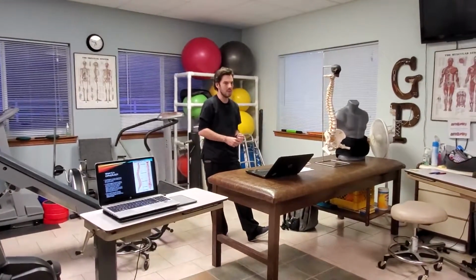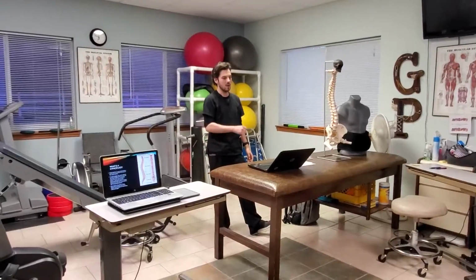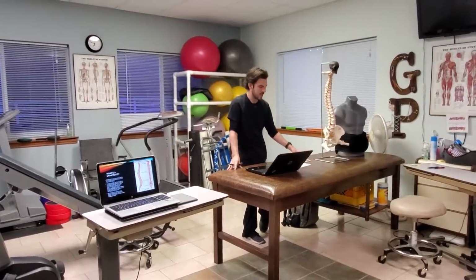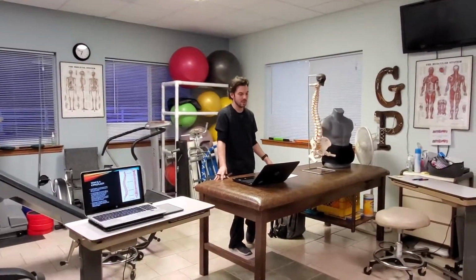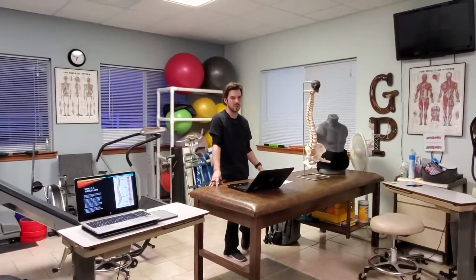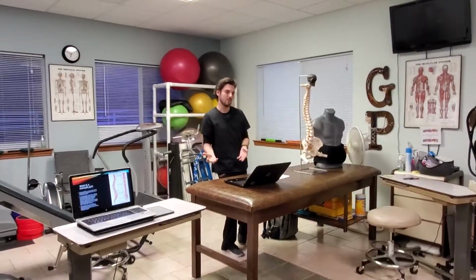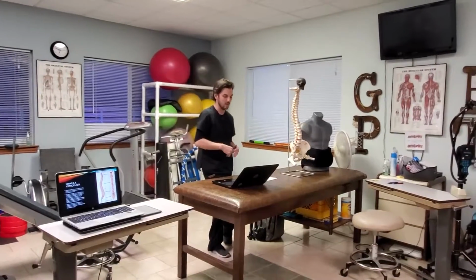So I will begin my presentation on what a kyphoplasty is. To put it simply, a kyphoplasty is a procedure that is done to correct compression fractures of the spinal column. Now, of course, compression fractures can take place anywhere in the body, but right now we're talking about the spinal column.